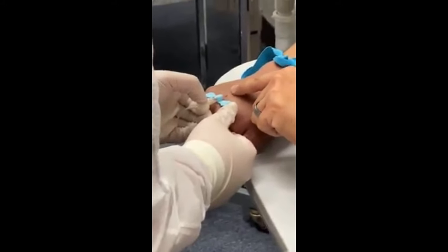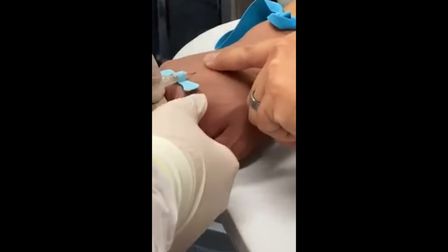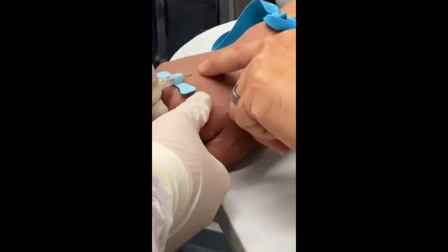Yeah, and you could also just feel here too. If there's any, just feel for the vein there. Okay, right here, I got it. Can I poke again on the top? Or actually, hold on.